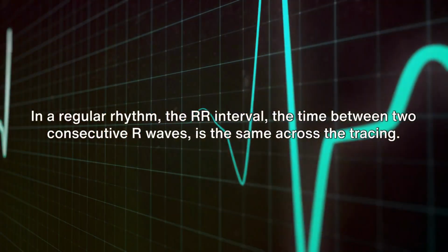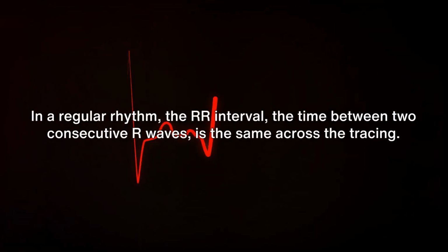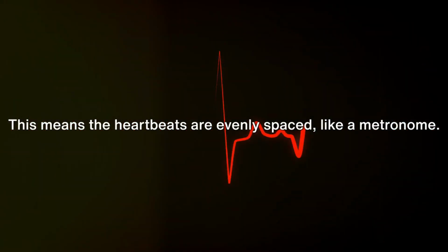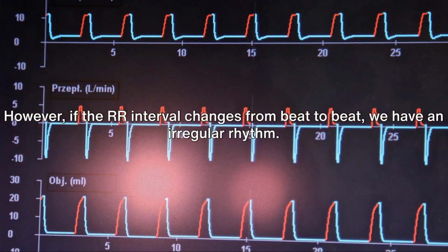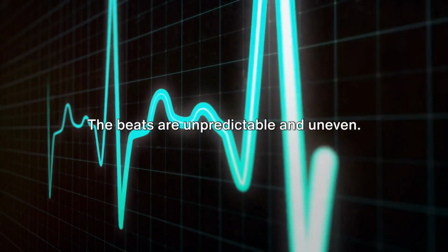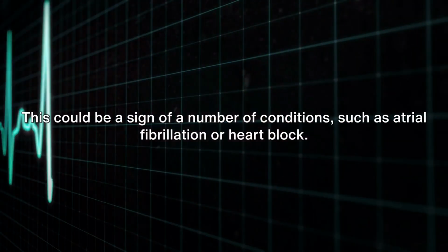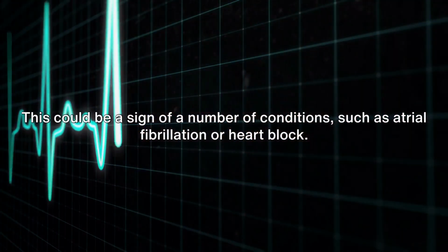In a regular rhythm, the RR interval, the time between 2 consecutive R waves, is the same across the tracing. This means the heartbeats are evenly spaced, like a metronome. However, if the RR interval changes from beat to beat, we have an irregular rhythm. It's like a drummer who can't keep time. The beats are unpredictable and uneven. This could be a sign of a number of conditions, such as atrial fibrillation or heart block.